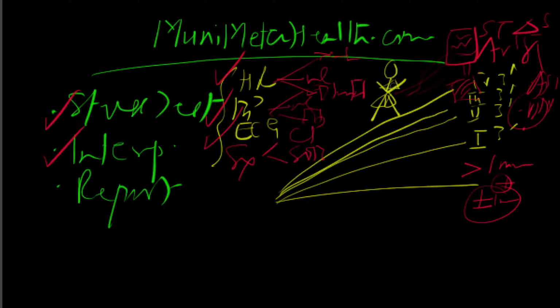So the patient toiled, you spent all your time, and next thing is you don't have an answer for that person, and now the test goes back into the hands of the internist who referred, and says, I didn't even get an answer from the doctor. So it's very, very important. Try to give an answer, whether it's a negative answer or a positive answer, but try to keep less than 5% of your testings annually to be non-diagnostic for any reason. But otherwise, if you have too high a non-diagnostic value within your lab, then your lab is not performing too well. That's how I see it from a quality standpoint.